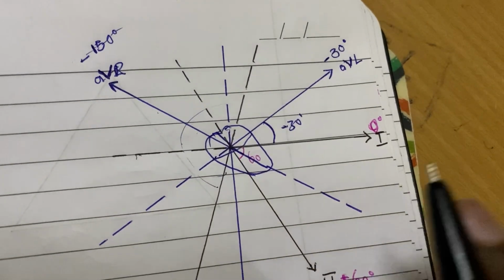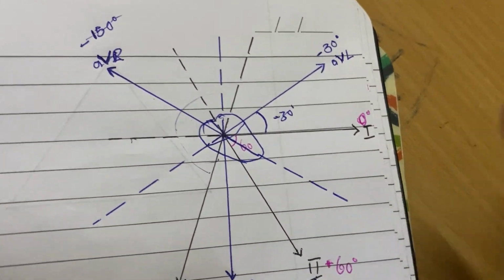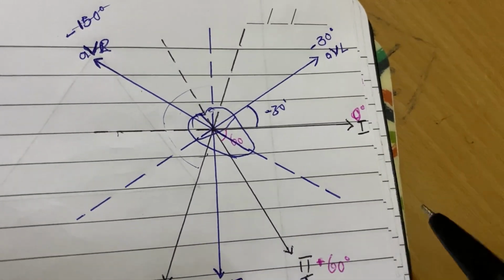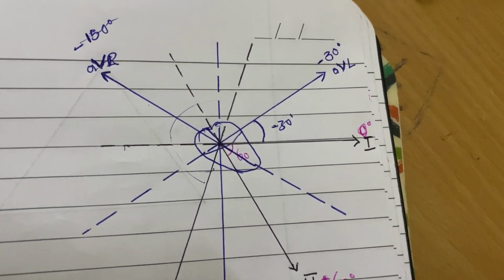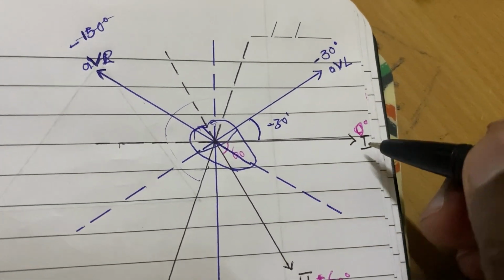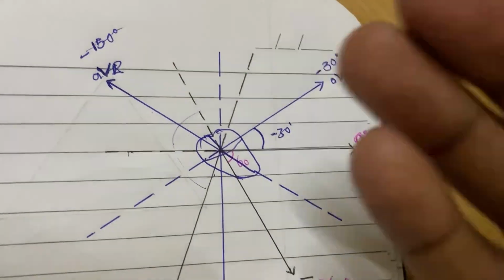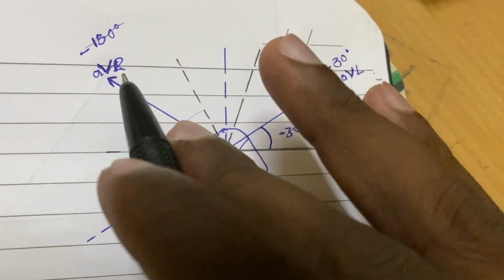So with these 6 limb leads, we can see the heart from inferiorly. We see the heart from laterally with lead 1 and the AVL, and then we see the heart even from the right side with the AVR.